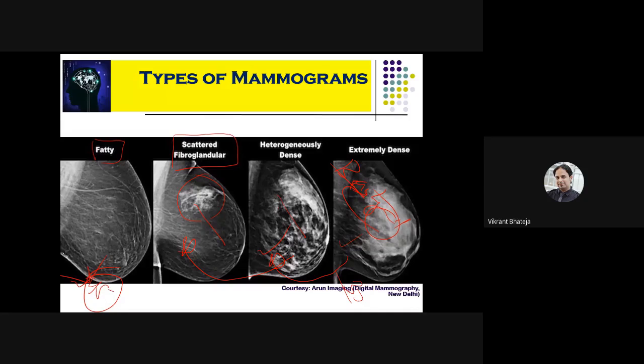Ultimately, at the higher age, say 45 or 50 years, the breast region becomes quite fatty. You don't have these white fibro tissues, and it becomes very easy to locate the tumor by the screening technique. That is why we say that for a younger woman, it is very difficult to detect this type of cancer.